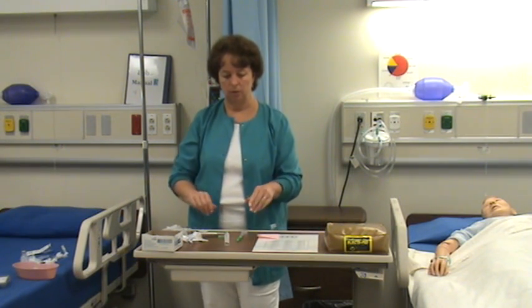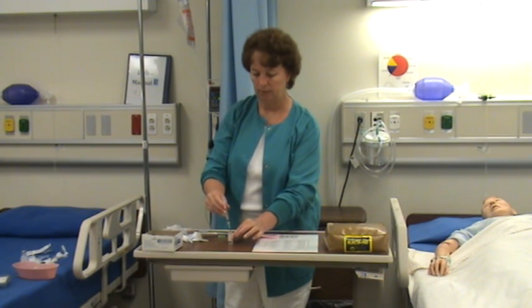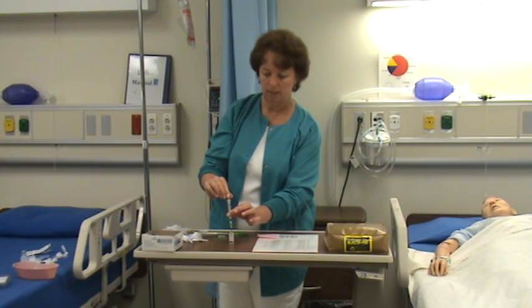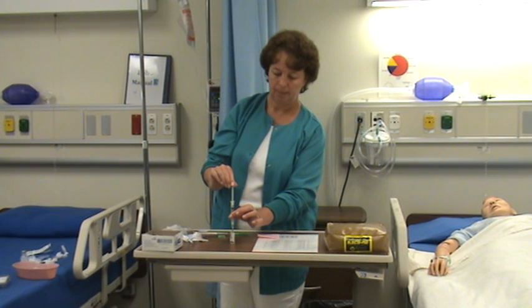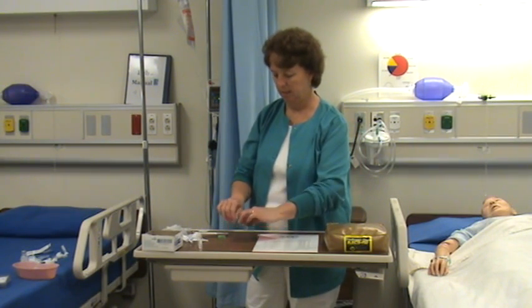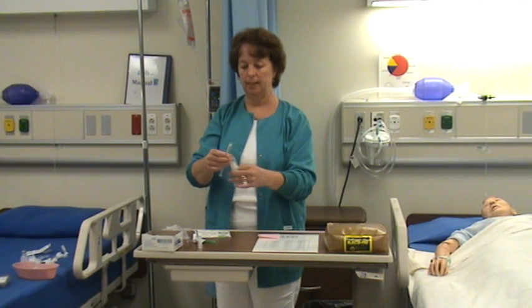Now I want to withdraw the fluid with my filter needle. I put the needle into the ampoule — if you look at the filter needle, it's a pretty good-sized needle. I'm going to withdraw the fluid up. Initially you'll have air because the needle is empty, so I'm going to pull past what I need and draw up most of the fluid. I pulled up almost the whole two milliliters. Now I'm going to recap with one hand and remove that needle, then replace it with the needle I'll be using for injection.